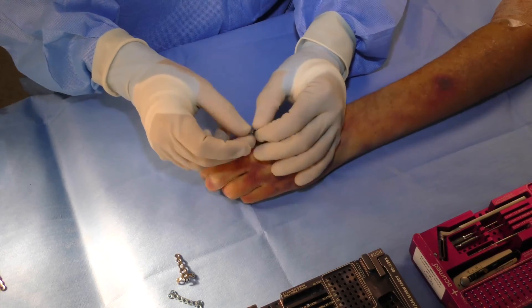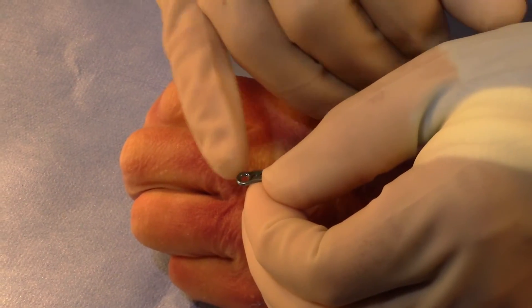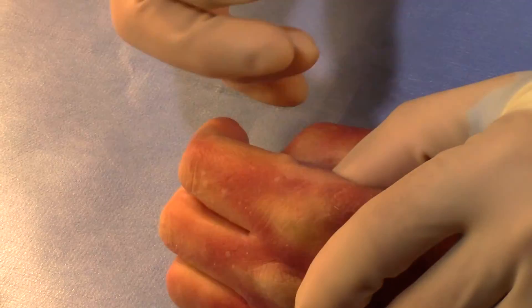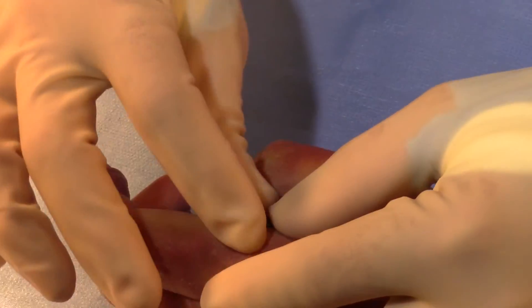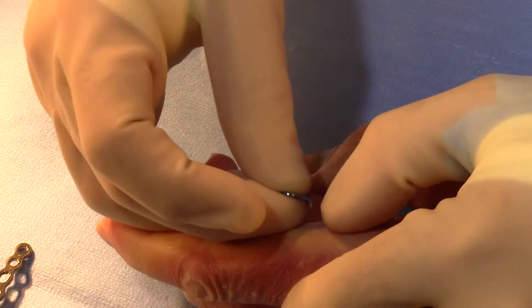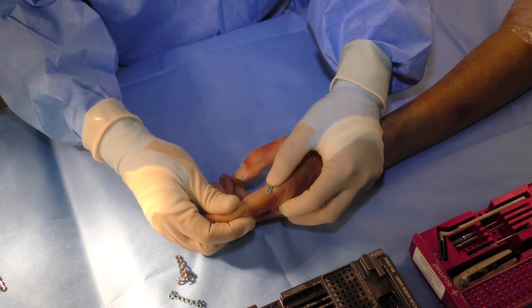The avulsion plate is unique in that it has a K-wire hole, a screw hole, and hooks to hold onto the avulsed fragment of bone to which a ligament is attached. Typically this plate would be used at the base of a phalanx avulsion fracture, and would be better demonstrated once the skin has been retracted.